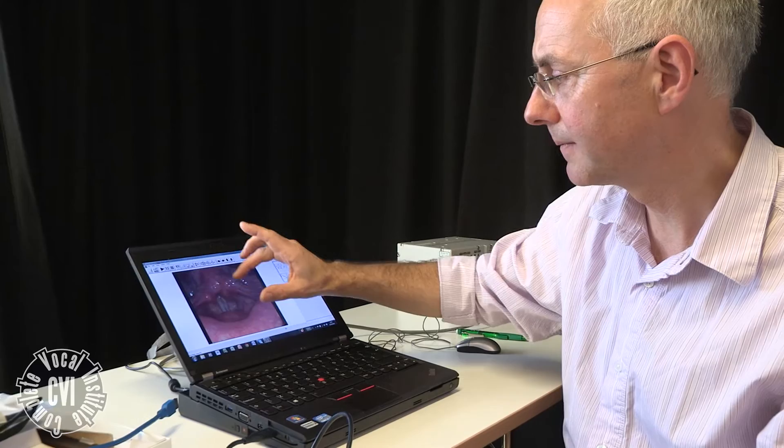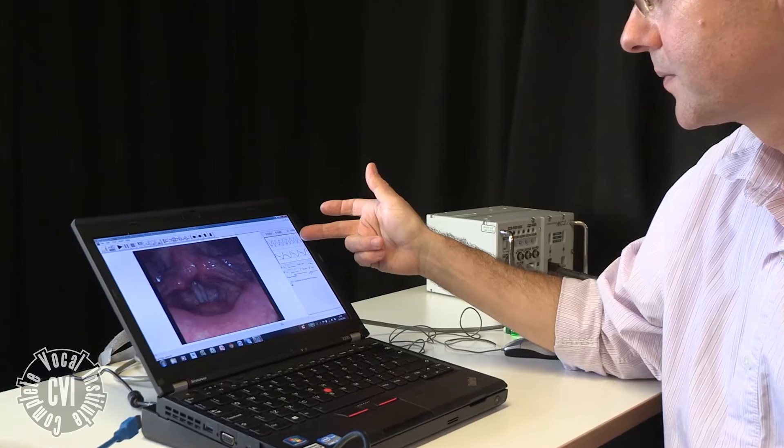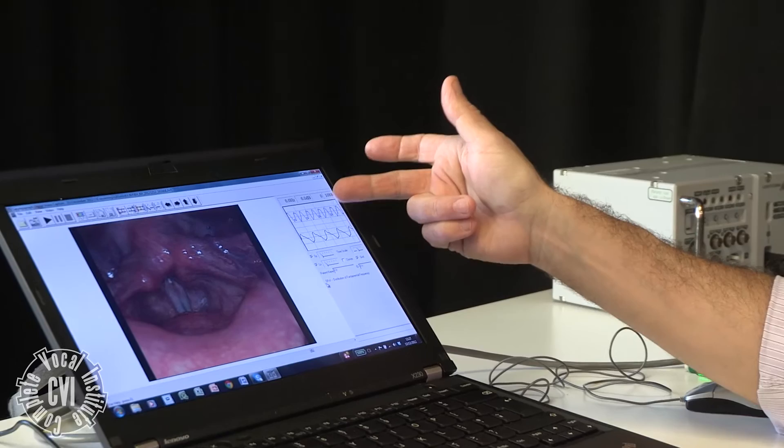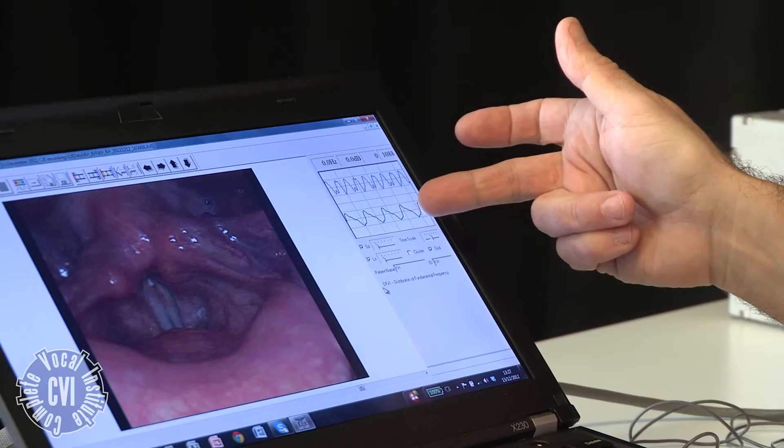We can also look at the blue trace, which is the acoustic signal, and the green trace is the laryngograph waveform.